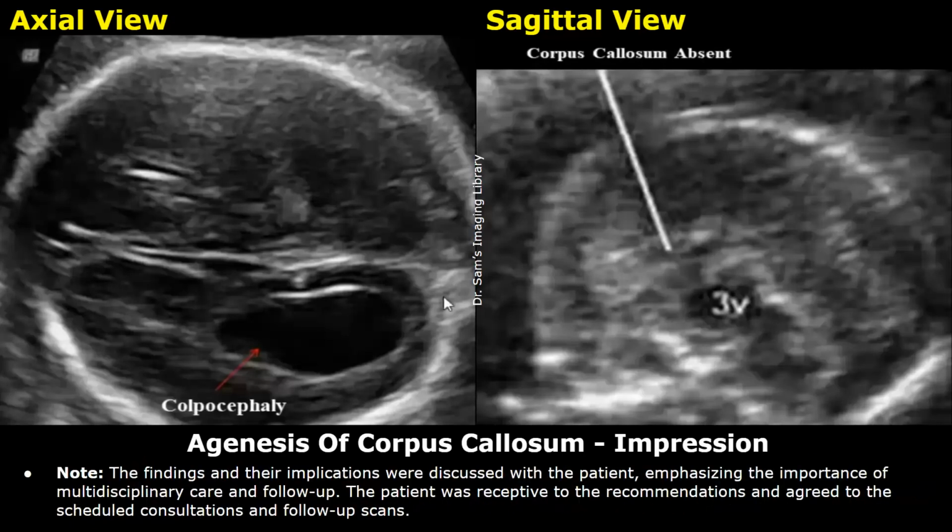Note: the findings and their implications were discussed with the patient, emphasizing the importance of multidisciplinary care and follow-up. The patient was receptive to the recommendations and agreed to the scheduled consultations and follow-up scans.